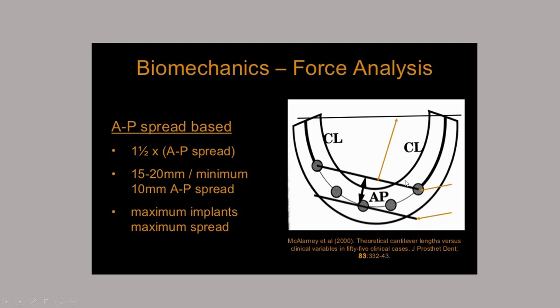If you have an angulation where one is further distal than the other, just remember that distance will increase back this way as well as this one. And so if this one's further back, you're not going to go as far back, because it's still only going to be 1.5 times that distance. Again, there are many authors on this topic. You have to choose one, embrace it, and then build your policy around it.